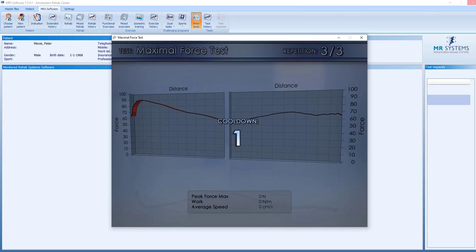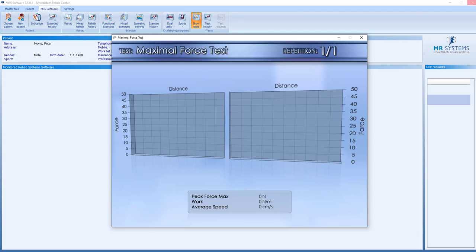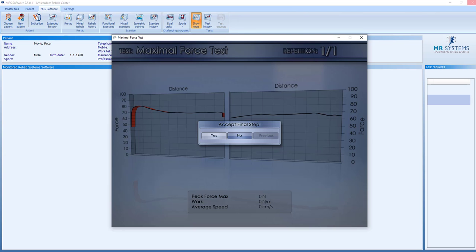We get the cooldown and we set the weight. In this example, we select the same weight. We ask our patient again to do the maximal speed, maximal performance up, slowly down. And we accept also this test.